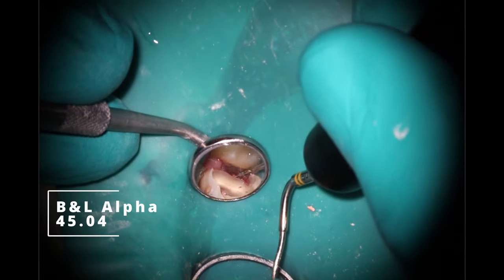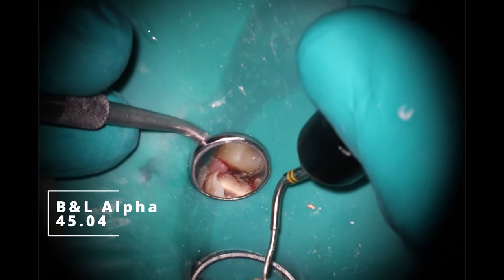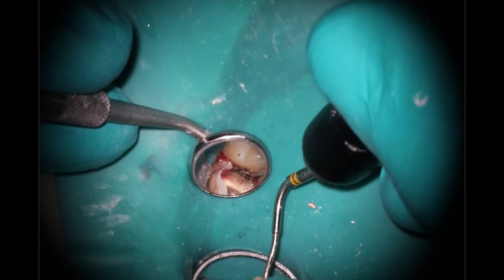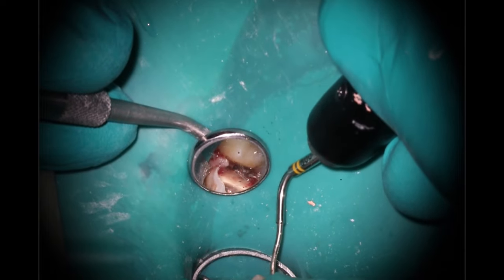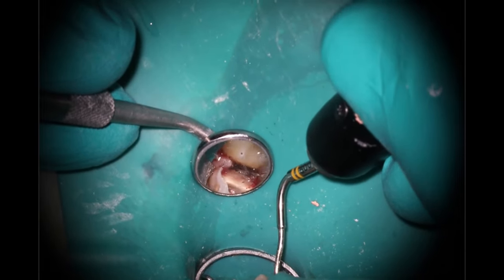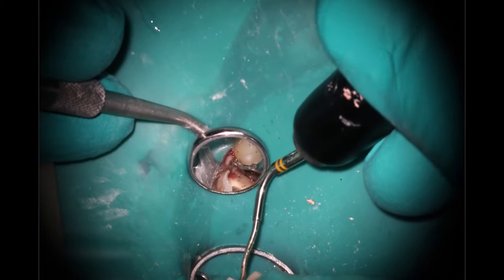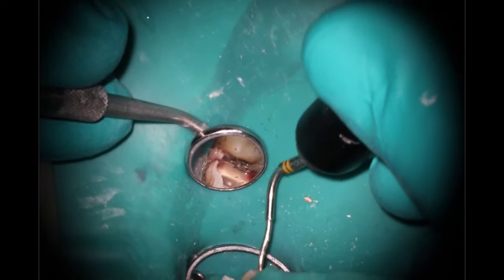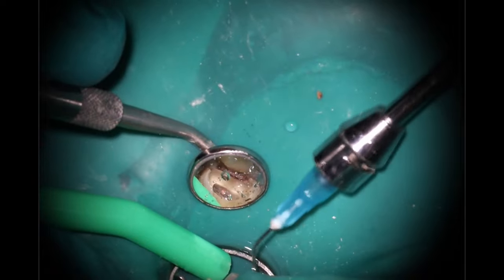During this time, what are you doing? I'm just making sure that my suction is in there. The chemicals inside don't really taste very good. But then also with the alpha tip, if the suction is in there, it's to prevent any smell, basically. Yeah, because we are cauterizing it. I've been mostly focusing on those papillae — both buccal and palatal — because that's where some of the more inflamed tissue is. We'll go back in and rinse again, getting things nice and dry because we don't want any bleeding; we want to have as good a bond as possible.